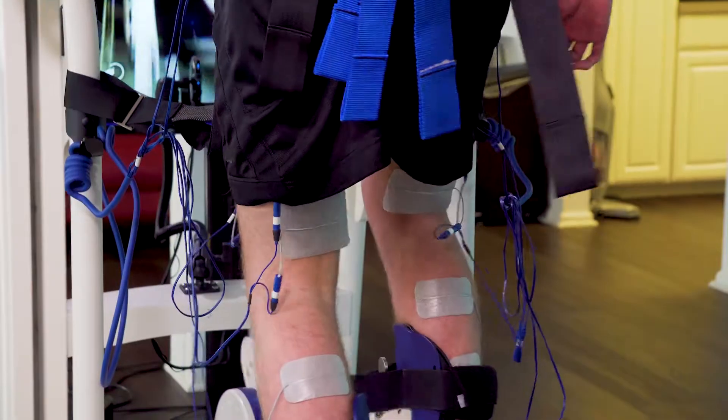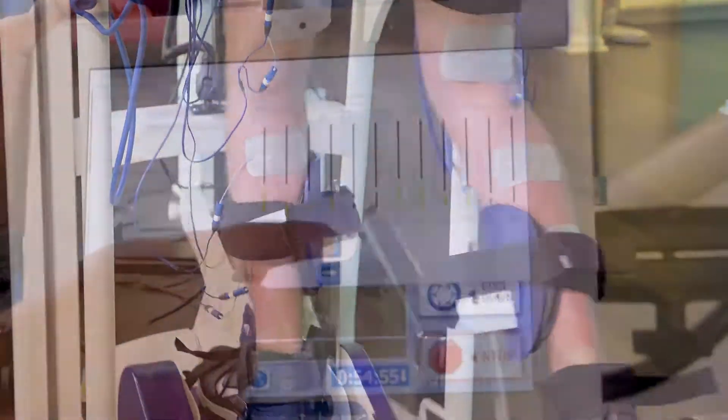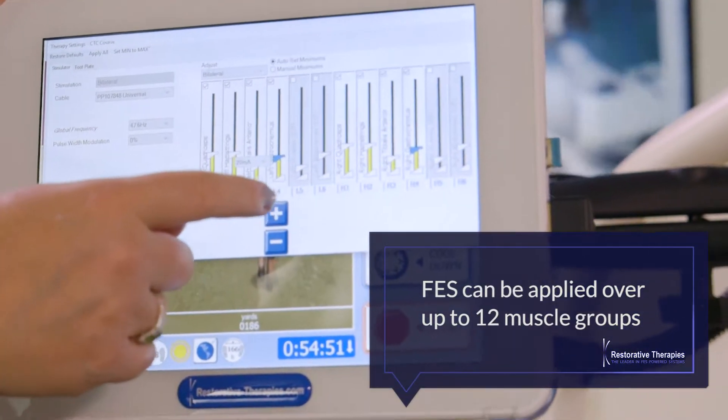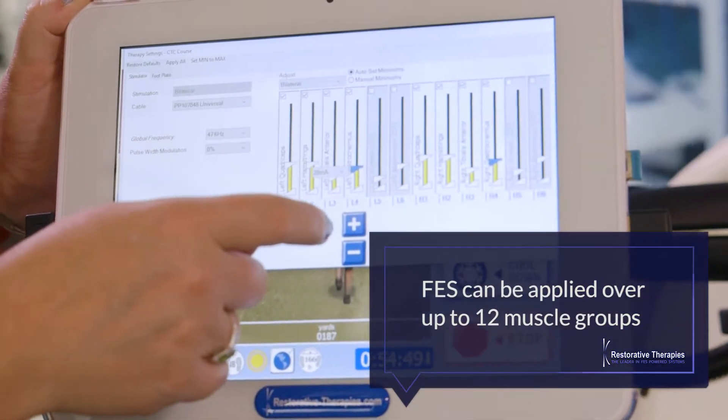The RT600 is also the only stepping system with fully integrated functional electrical stimulation that can be applied to up to 12 muscle groups.